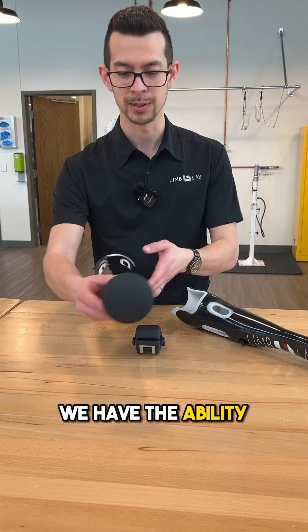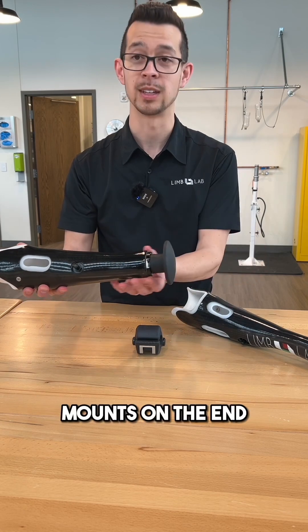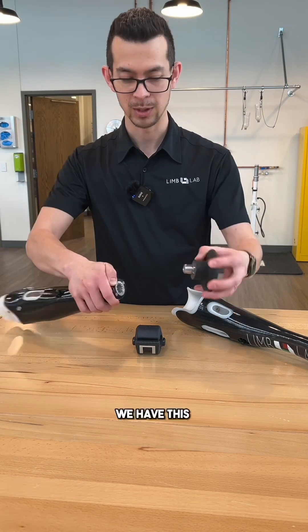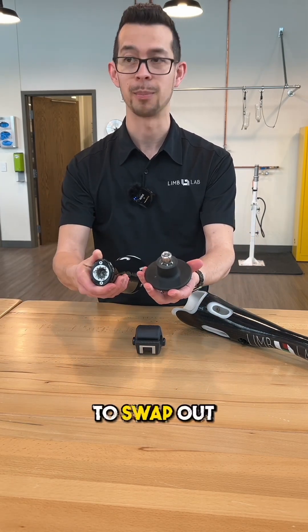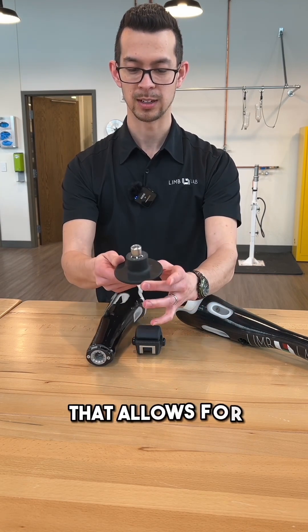Looking at this first one, we have the ability to exchange our terminal devices. A terminal device is what mounts on the end of an upper extremity prosthesis. We have this quick change that allows us to swap out what device we have. This is called a mushroom — a silicone piece that allows for different activities.